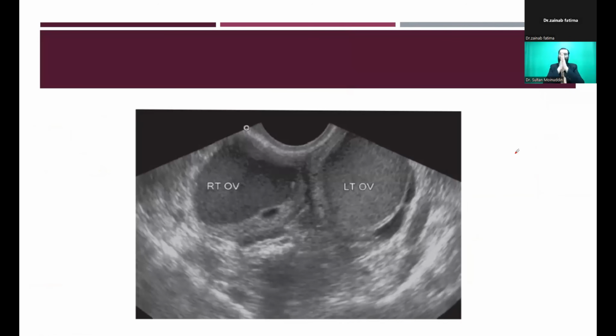Okay, now I show you an image. What is it? What do you think is the image? Yes, I'm getting few answers. Very good, Rashmi. Very good, Fauzia. You're correct with this.